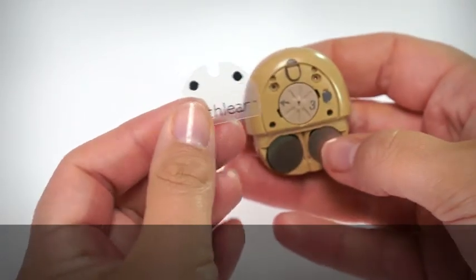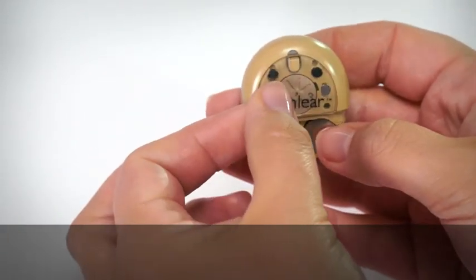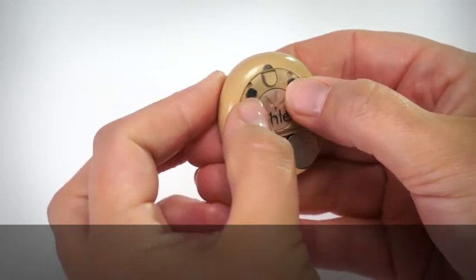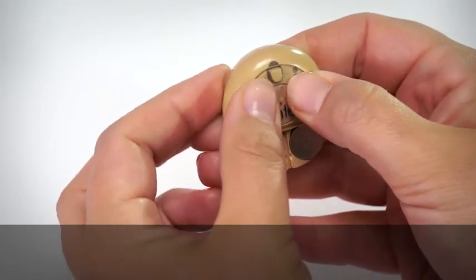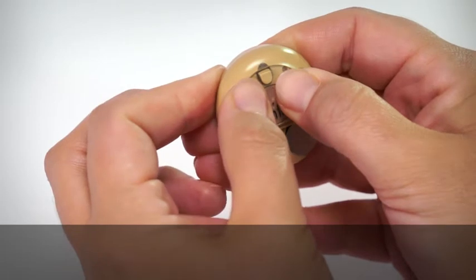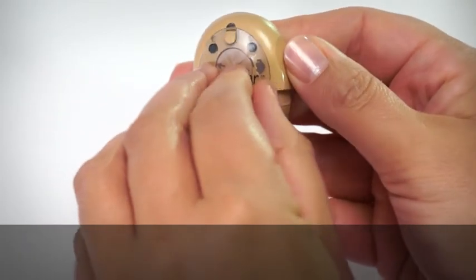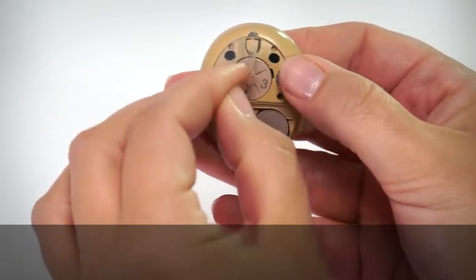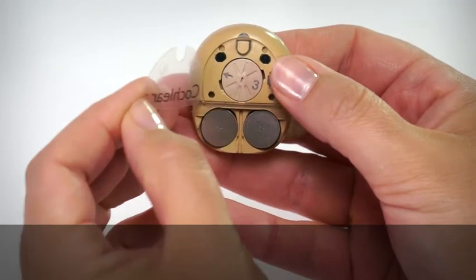lay the applicator over the processor, aligning the protectors over the microphones. Press the microphone protectors down with your finger. Remove the applicator carefully by peeling it upwards from the side.